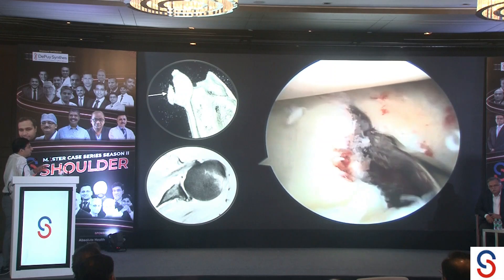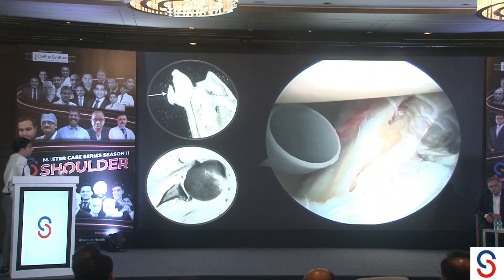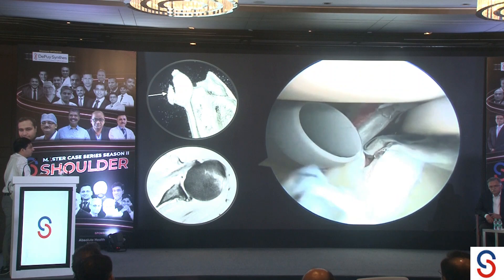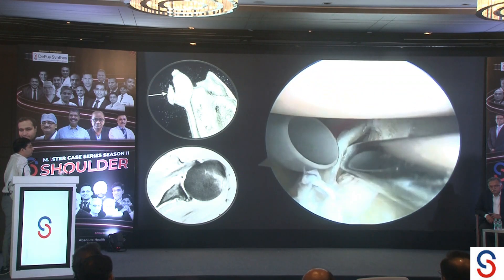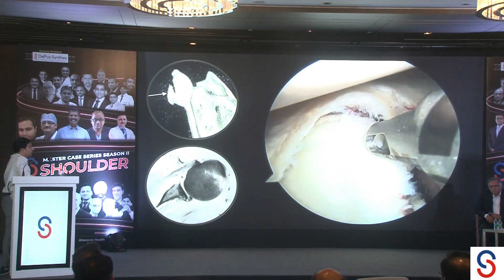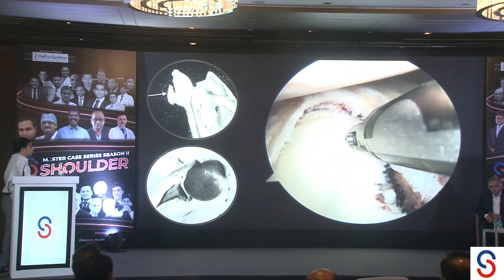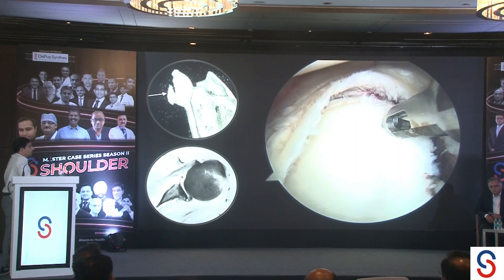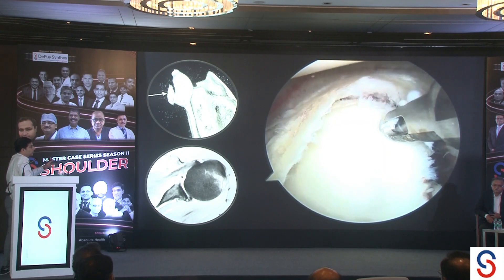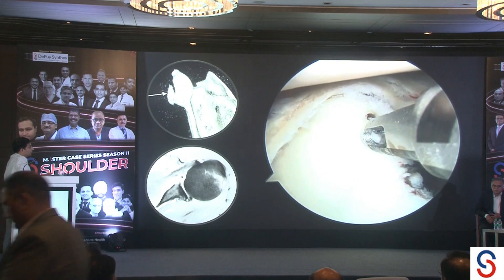I am visualizing from the anterosuperior portal with my working portal being the standard anterior portal. The gray cannula is at the posterior portal, where the bucket handle is visible. The question is whether to excise this bucket handle of the posterior labrum — but since it is a large, acute fragment in a young patient, I am going to retain and repair it. Using a curved delivery device, everything can be done with just three standard portals: the anterosuperior viewing portal, the posterior portal, and the mid-anterior portal.